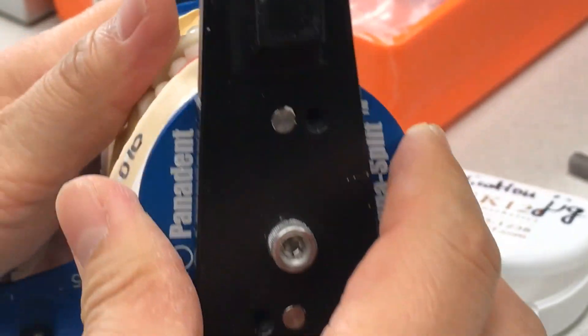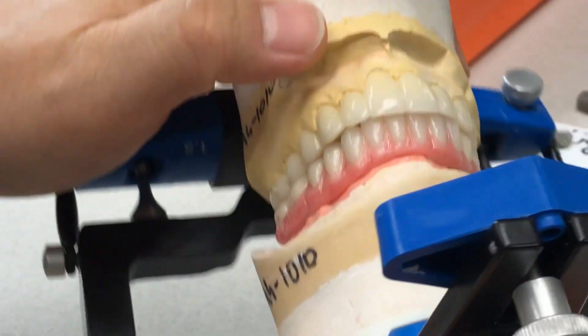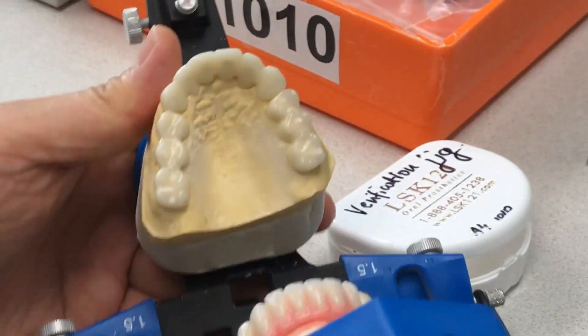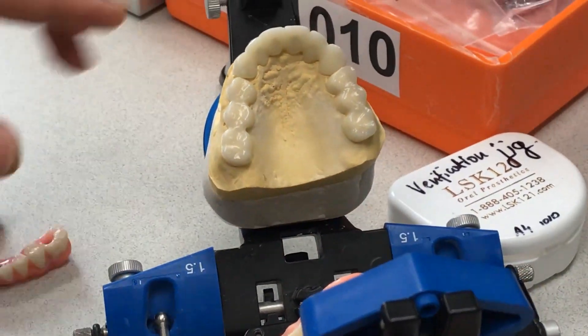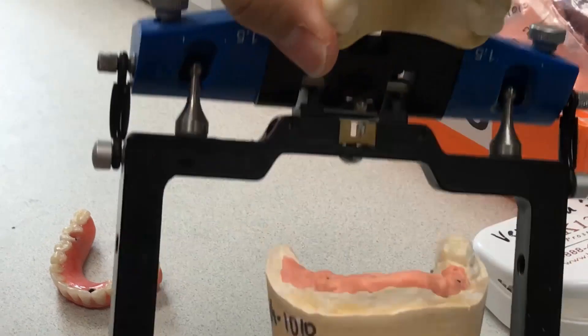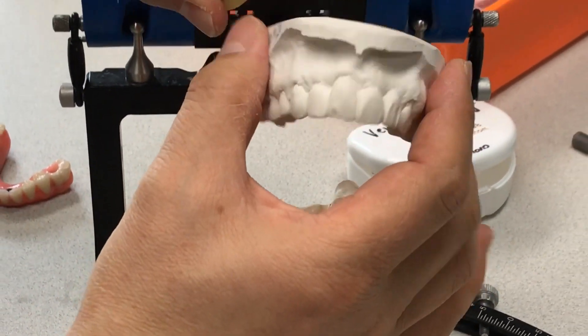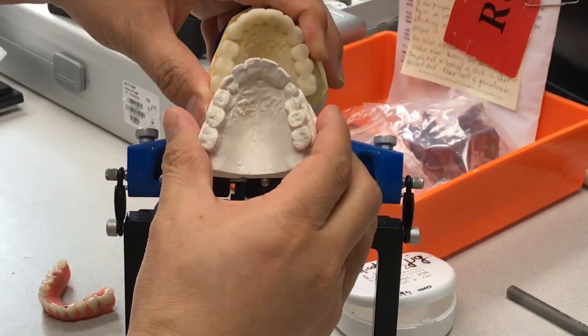So this is our final goal from this case — the implant and the old restoration. Here's the before and after.